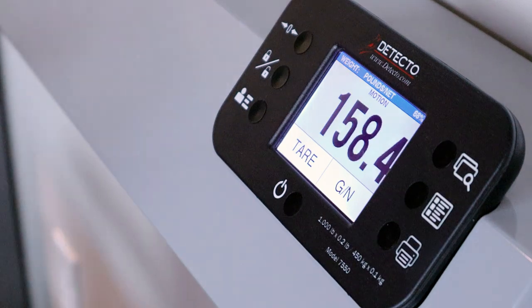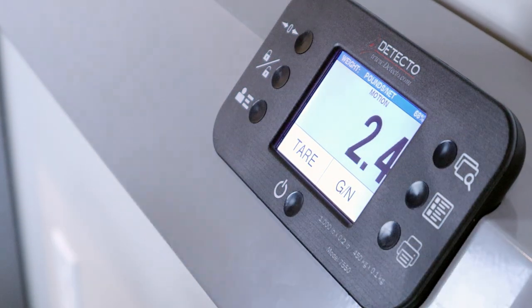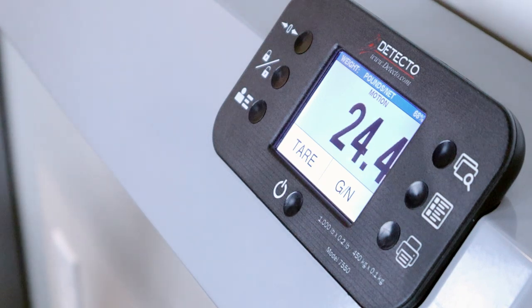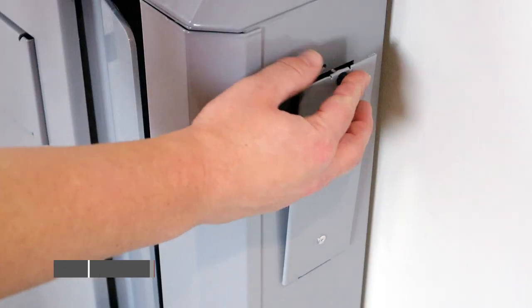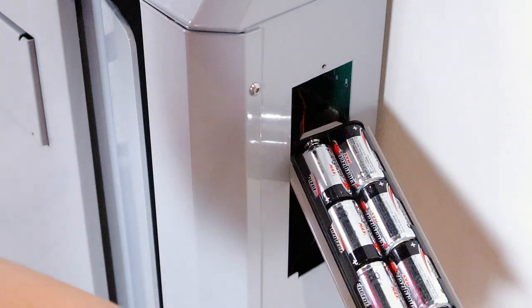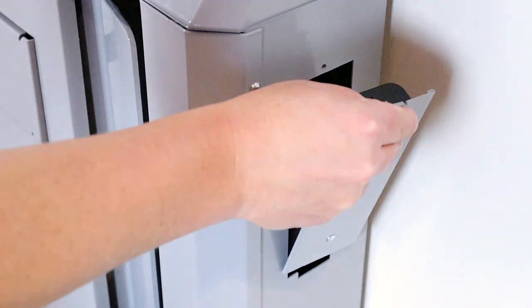The clinical grade accuracy of 0.2 pounds (0.1 kilograms) makes this scale ideal for a wide range of clinical weighing use. The 7550 operates on six C-size batteries, and the 7550 AC model comes with an AC adapter.